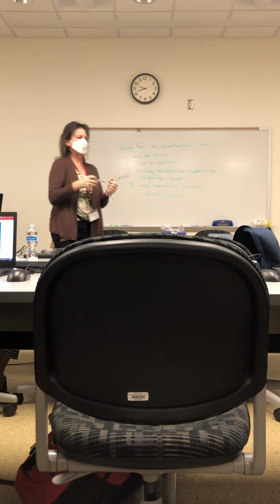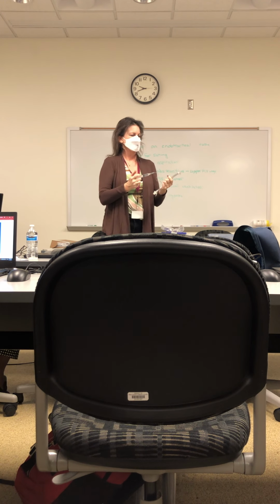Okay, and we're going to inflate our balloon. You have to do it again. We need to put more air into it. See how it's inflated here?